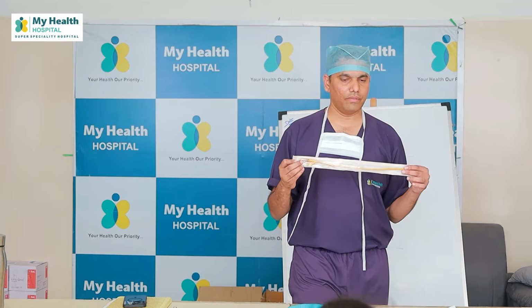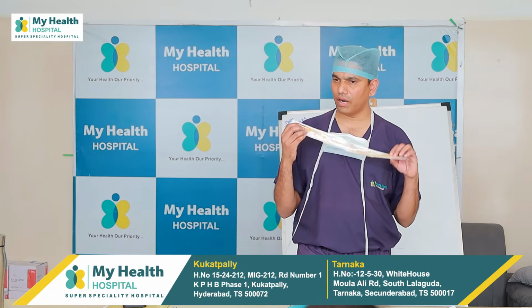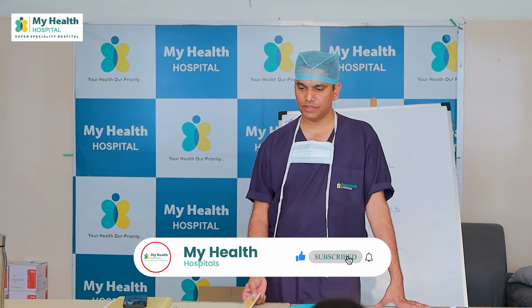Any other thing? Apart from regular urine drainage, where else do you use this Foley's? Tracheostomy suction, why do you use this? Very good. Another one, this is also for urine drainage, but we use it in another place. Where? SPC. SPC is one more indication where surgical intervention uses it. Suprapubic cystostomy.